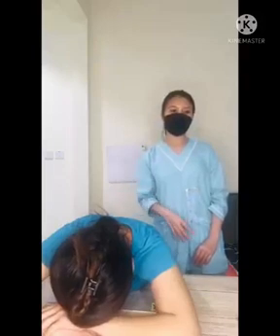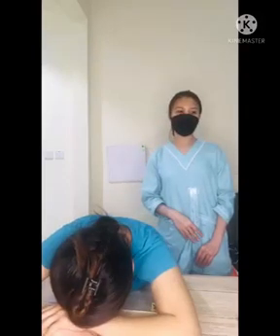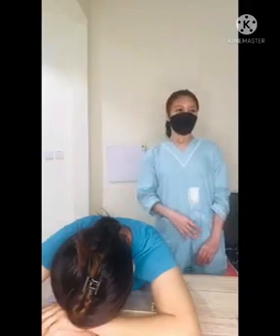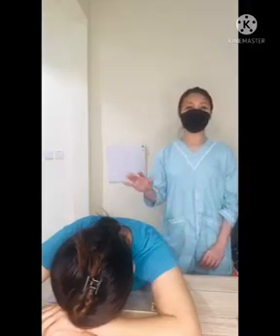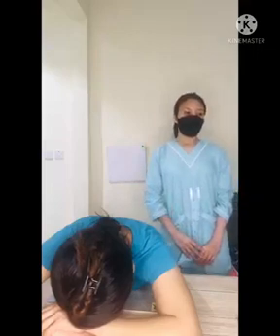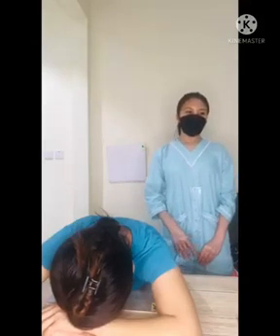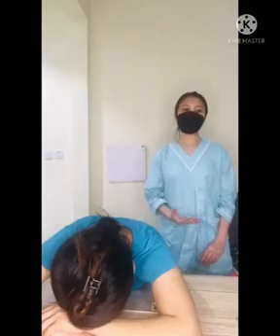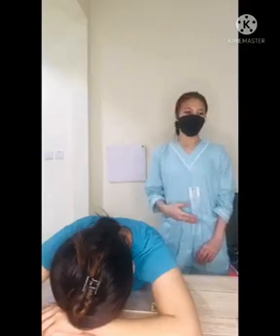Place the patient's arms above the shoulder and palm down on the table. Ensure that the patient is in true prone position. Head is turned away from the tube. We must instruct the patient to take slow and shallow breathing during the exposure.